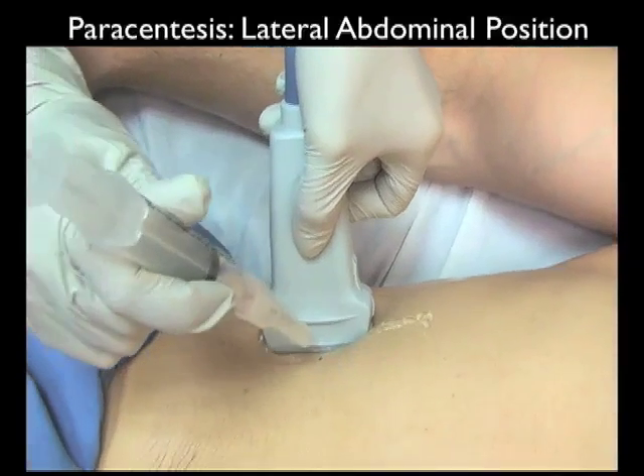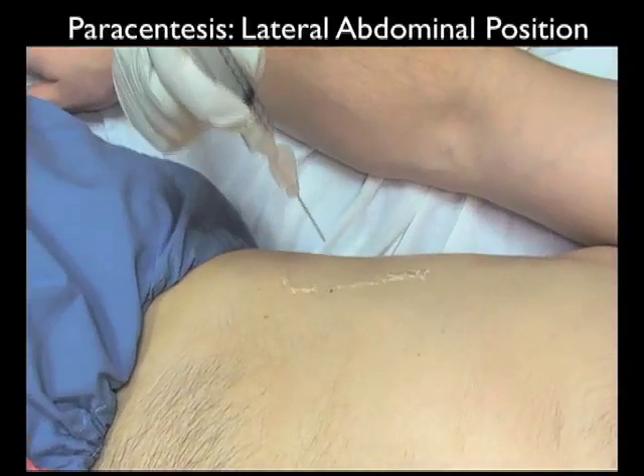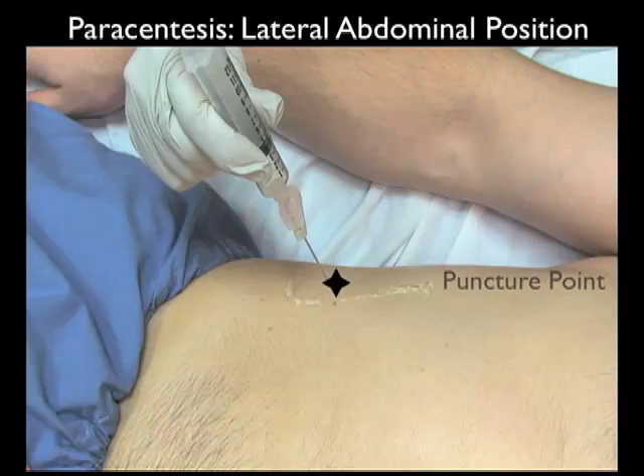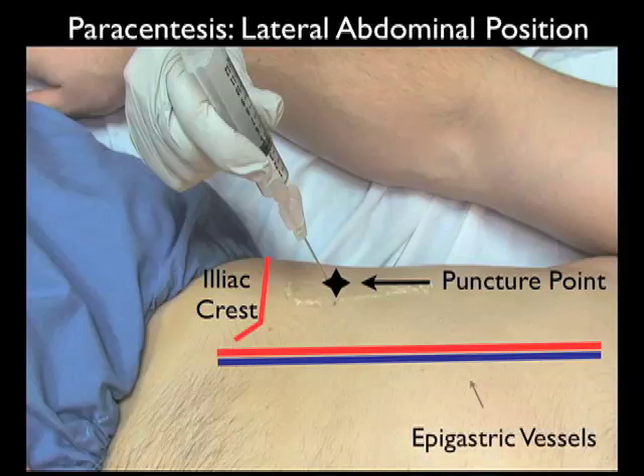In this video clip we'll reemphasize the surface anatomy for the lateral abdominal position for paracentesis. Note we're coming with a capped needle underneath the 10 megahertz probe at the lateral puncture point — the preferred position for the lateral approach, shown by the black star. Surface anatomy includes the iliac crest; we're about 4 to 5 centimeters above it. We want to avoid the epigastric vessels, visible medial to the puncture point. Using ultrasound guidance we can map out the best position, go either right or left depending on the maximal ascites pocket, ascertain the locations of the liver and spleen to avoid solid organ injury, and look for intestine with anchoring mesentery to avoid intestinal puncture.